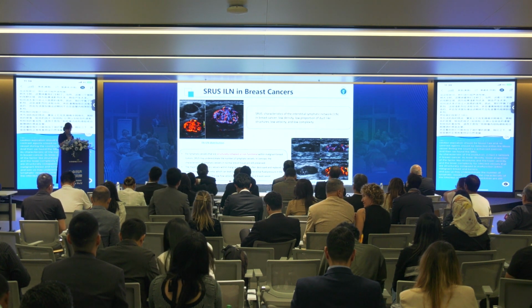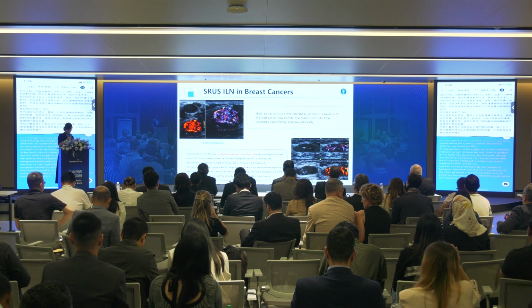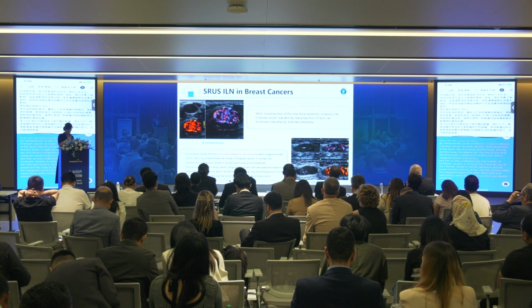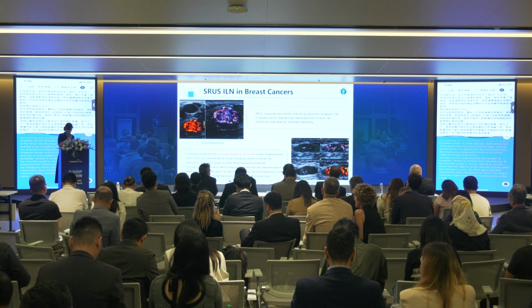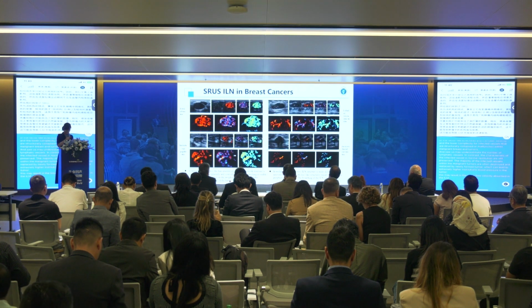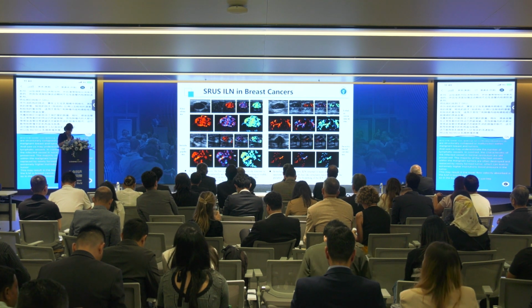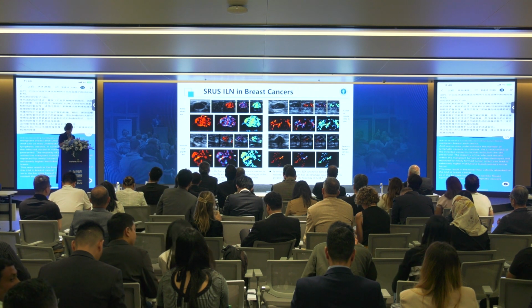The majority of lymphatic vessels within malignant tumors are often destroyed and replaced by newly formed tumor stroma, which can lead to extremely high interstitial fluid pressure in the tumor. This may result in the lower flow velocity observed in the ILN in breast cancer. So in benign breast tumors, like fibroadenoma, the fine interstitial lymphatic network structure is evenly distributed.